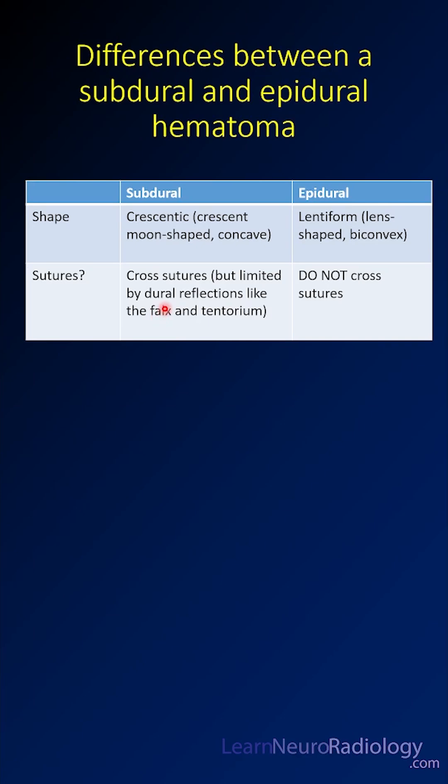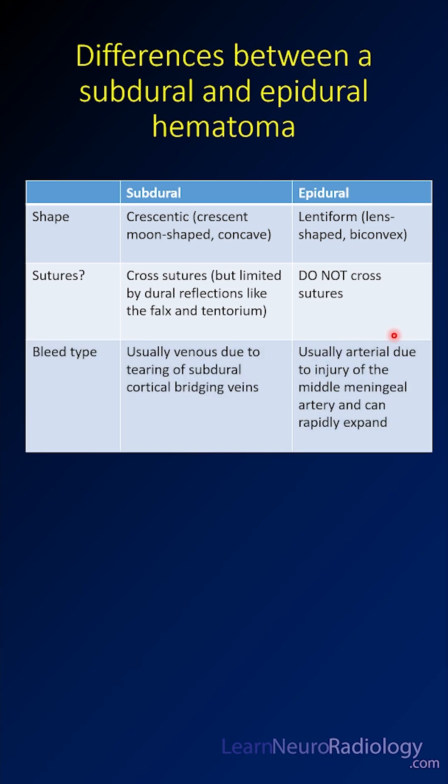Subdural hematomas cross sutures and go around dural reflections like the falx and tentorium. Epidural hematomas do not cross sutures.